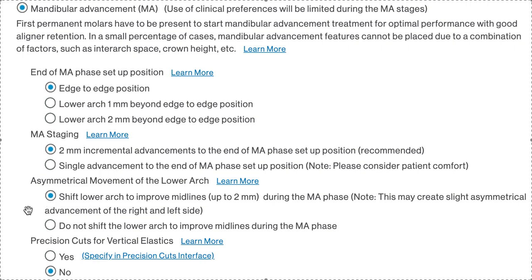No wonder. Because before I was like, oh, we should deprogram them before we do the MA so that we get rid of the shift, which is always a great idea. There's nothing wrong with that. Or do some initial alignment and see if the shift goes away, pull out some baby canine, see if the shift goes away. Nothing wrong with that. I have tons of content on getting rid of shifts in mixed dentition or in teens or in kids. You can go to my YouTube channel, put in the keyword shift, and you'll see all that. But obviously, if your midlines are on, they're not going to do this even if you click it.